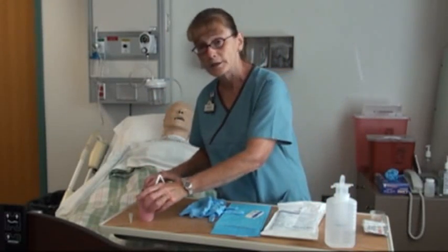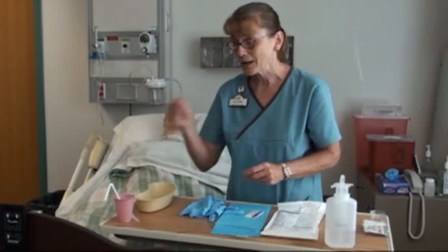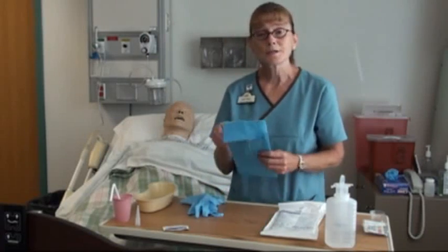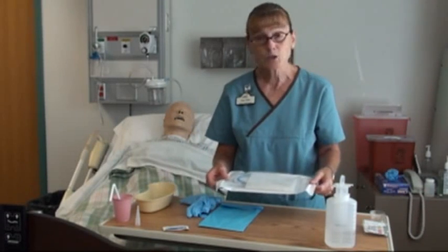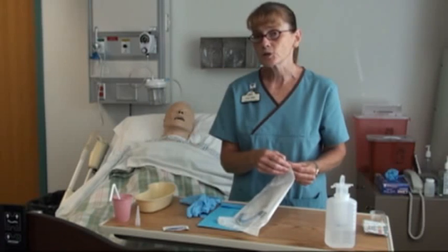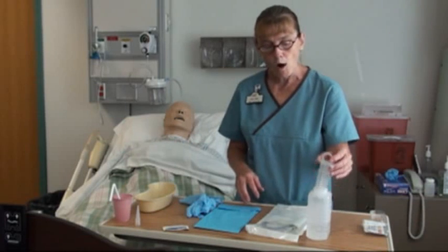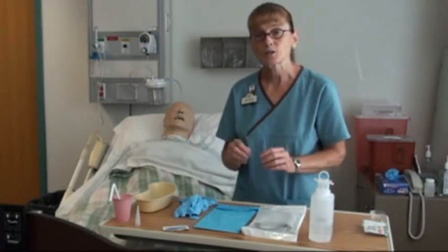The emesis basin and cup of water will probably already be in the room. The water and straw help the patient swallow as you advance the tube. If they can't drink water, sucking on a dry straw and getting into the sucking mode will also help. You'll need gloves, water-soluble KY jelly, and something to protect their chest — a linen saver is very nice. For suctioning or decompressing the stomach, we'll use a Salem Sump. Also have an irrigation tray with water and pH paper to check the pH.